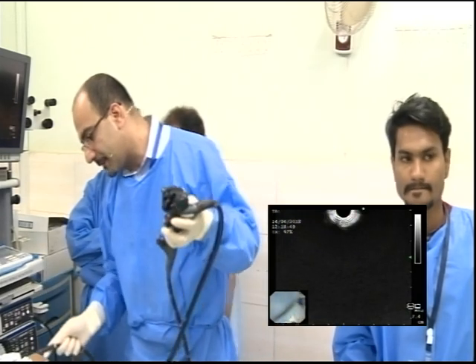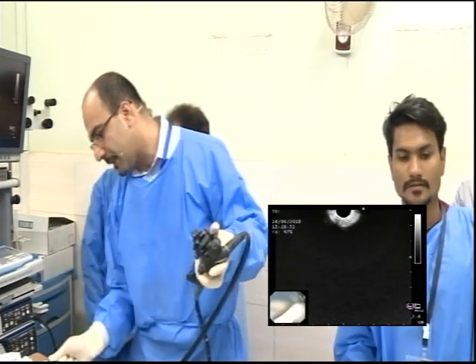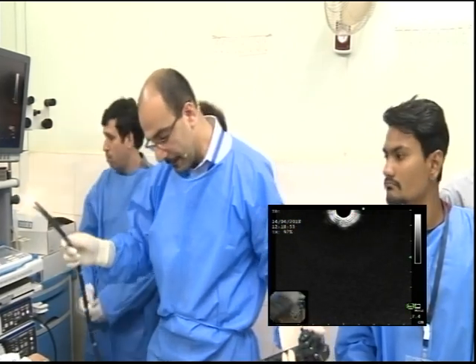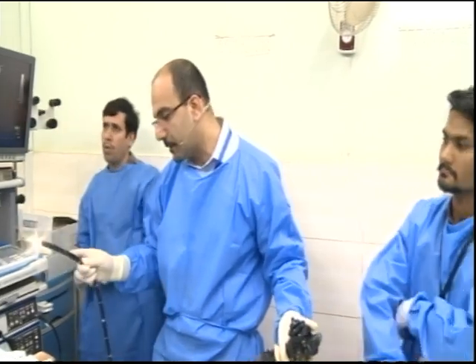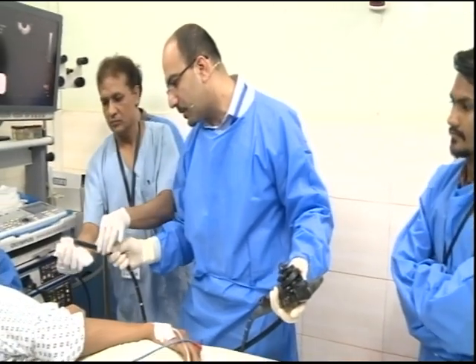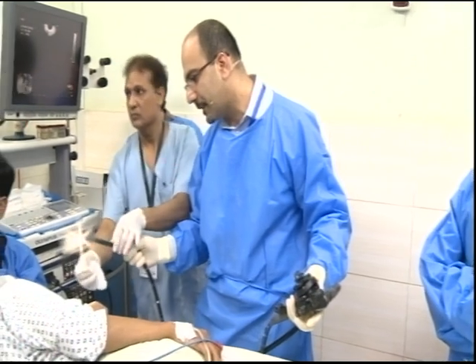The question is, is this a benign or neoplastic process? And he's 17 years old. There's no family history of pancreatitis. So again, I'll try and keep this not too long. Okay, I think Khalid has done a very detailed exam.